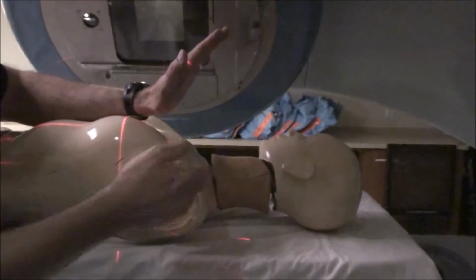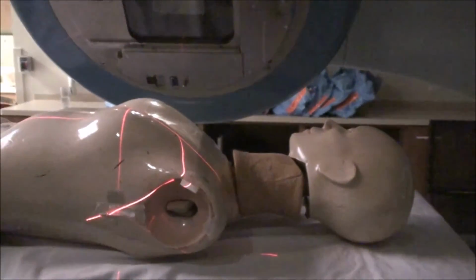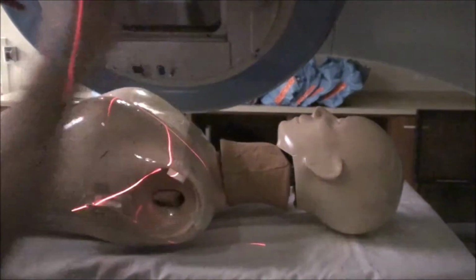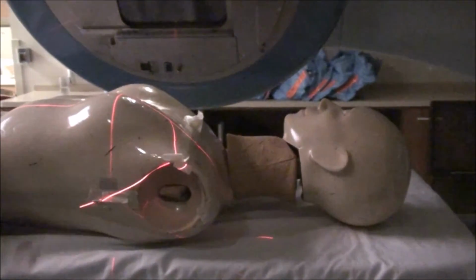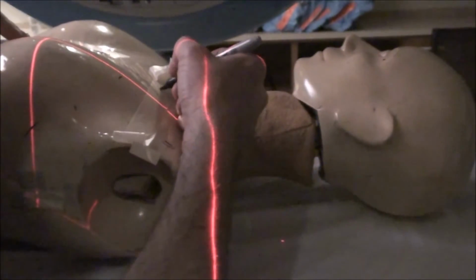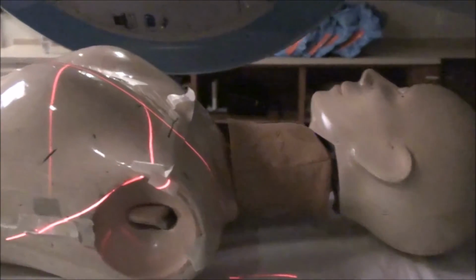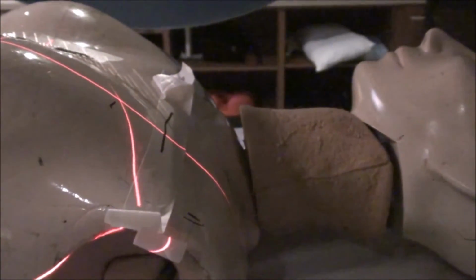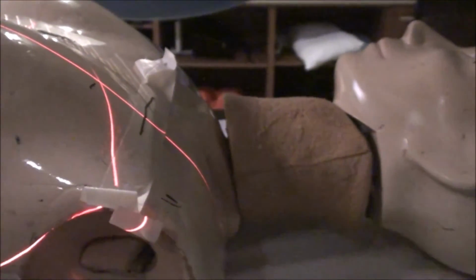Just like with the head and neck, you're going to lay a wire across that match line, and then we're going to pretend that we did that superclav already, and that our wire runs like this. You can see that we've got divergence problems. The way we fix divergence problems when we treat them and when we simulate them, you're going to kick the table away from the gantry.